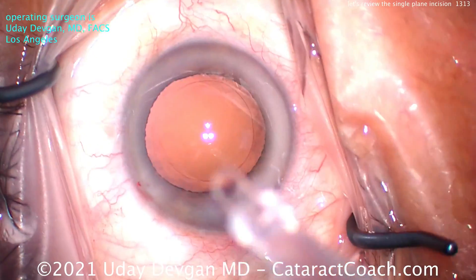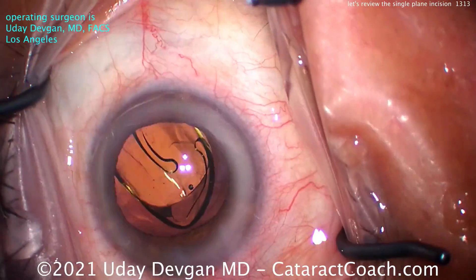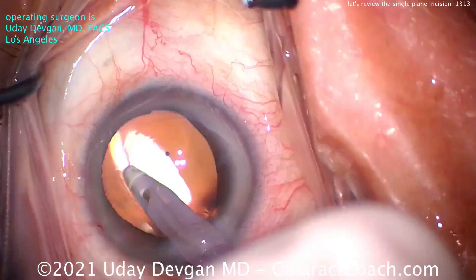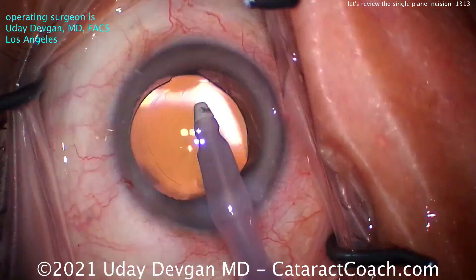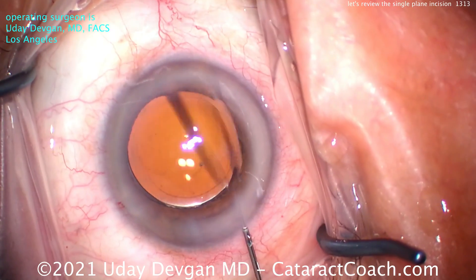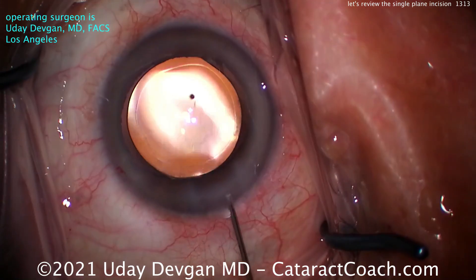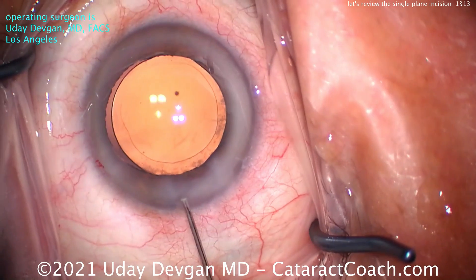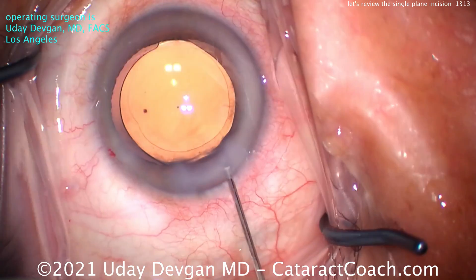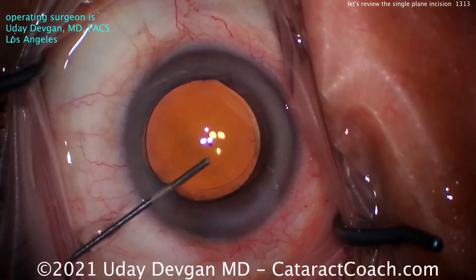So let's go now to the end of the case. We're putting in the lens, everything looks good. I want to show you how we hydrate the incision and seal it up, and how easily it seals because we created such a nice incision. Barely doing any hydration — just to the roof of the incision, back and forth. Do not do those big huge white spots of edema on the left and right side of the incisions. You're better than that. And that looks beautiful.